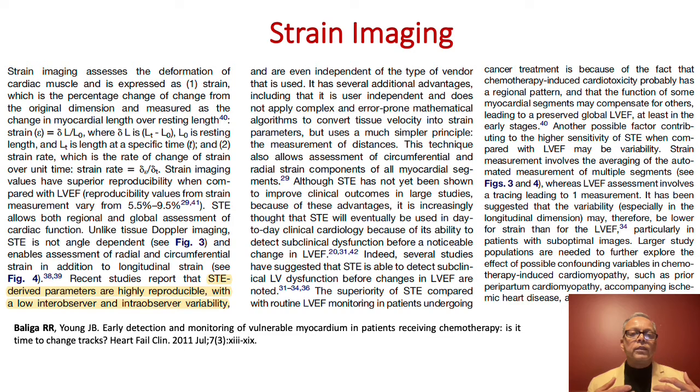The strain imaging derived parameters are highly reproducible, with low inter-observer and intra-observer variability. And we have been using roughly a change of 15% as an indicator of whether to initiate therapy for LV dysfunction in response to chemotherapy. So this is now standard of care.